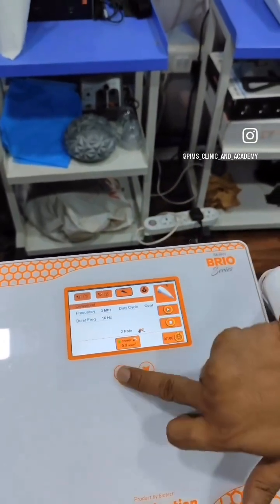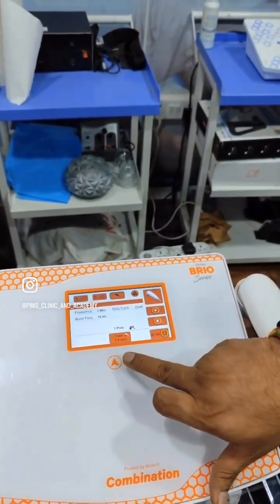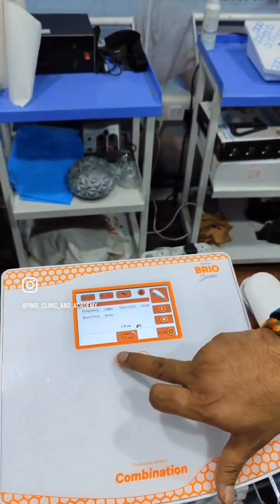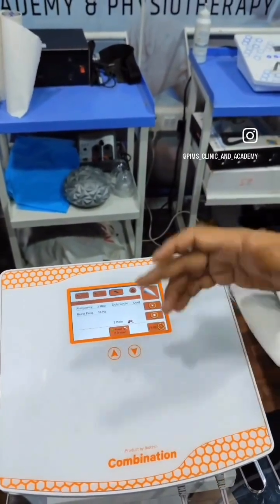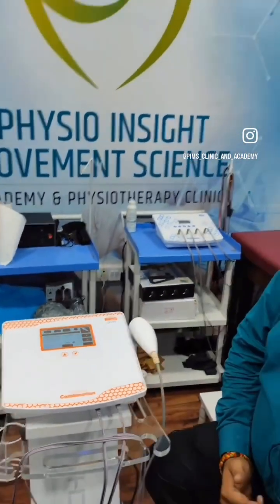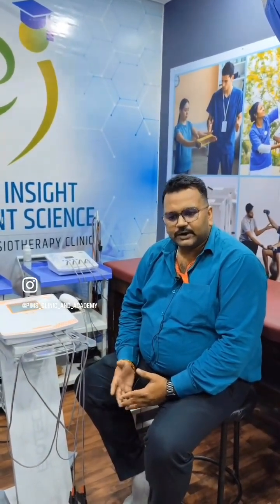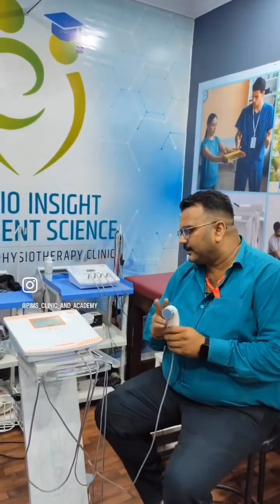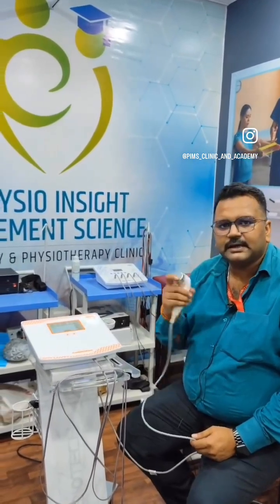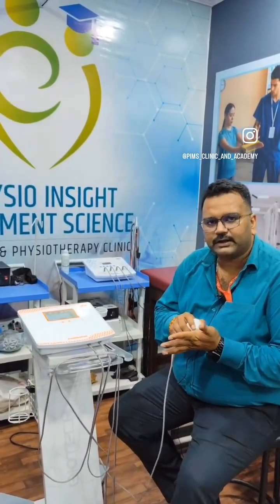Then power, whatever intensity. The therapeutic effect starts from 0.8 to 1.2 for acute conditions, 1.2 to 1.5 somewhere we use for subacute conditions, and for chronic I normally prefer to go for 2 watt per centimeter square. That depends on the area we are treating, the size of the head and the duration also. When you start this machine, you can play from here, and a very important thing about this machine is it will not start unless you apply the gel or it is in contact with the skin.